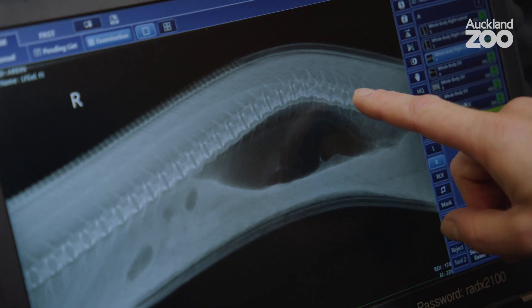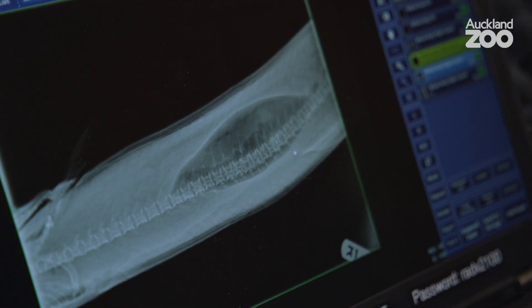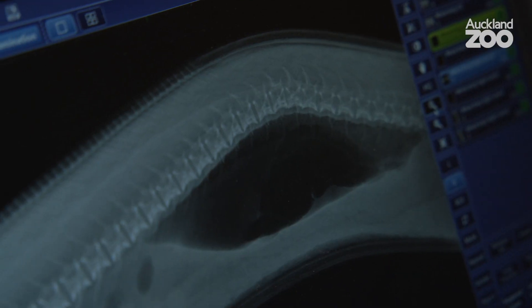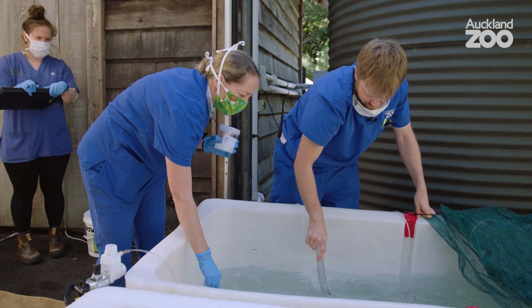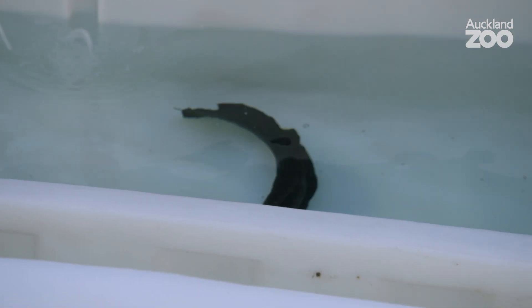We'll hopefully get a better image on the high-def screen back at the clinic in a dark room to see if there's bony damage — it certainly doesn't look like a fracture. As far as we can tell, this is the first time on record that anyone has done an anesthesia and x-ray on a longfin eel. The process we used is a very tried and tested method in other fish — sometimes even sharks and rays — but our opportunity to do it on native freshwater fish is very limited. Having done the procedure, I think it went really well, quicker than we thought, and as good as we could have expected.